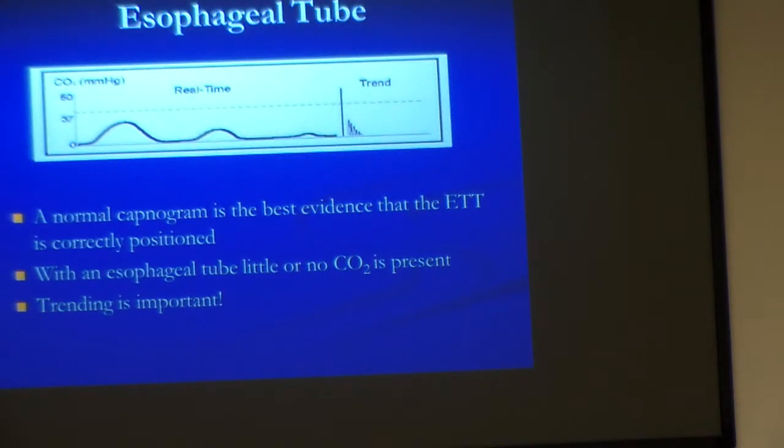Standard practice when I transported patients was, as I transferred them in the ER, do not take the monitor off until you hit that snapshot. Because if the documentation comes back asking, was that tube in? Yes, there's the ER time when I transferred that patient, and there's my snapshot with my square waveform, and there's my numbers. That's my saving grace in a court of law. I tubed that patient. It's very true.